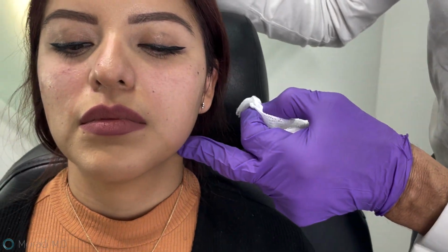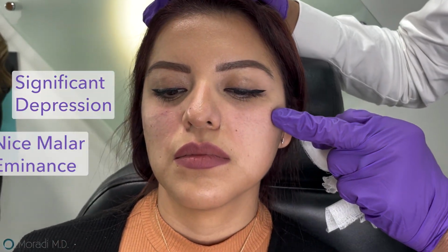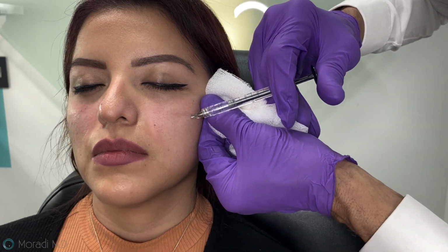So once again, we're just going to take a look here. You can see the significant amount of depression here. We have the nice malar eminence. We're going to use malar eminence as our guide. Entering slowly, feeling for any resistance at the tip of the needle.